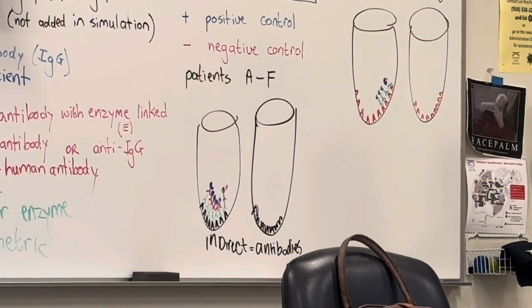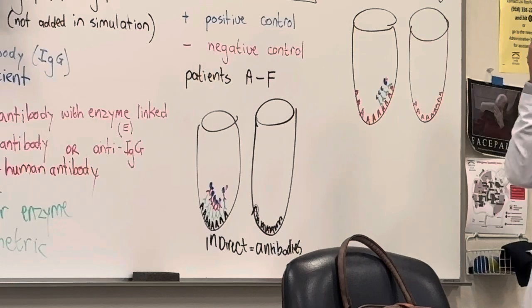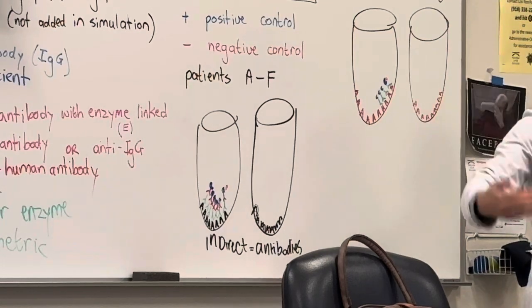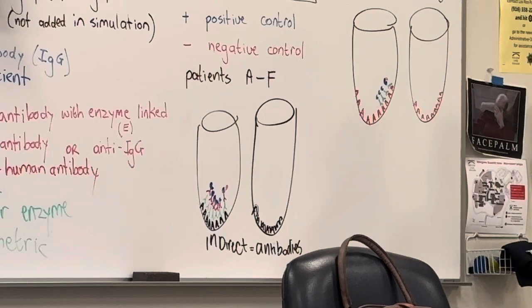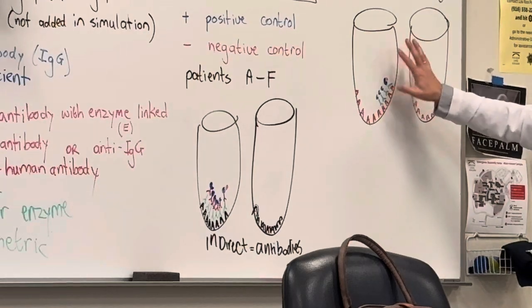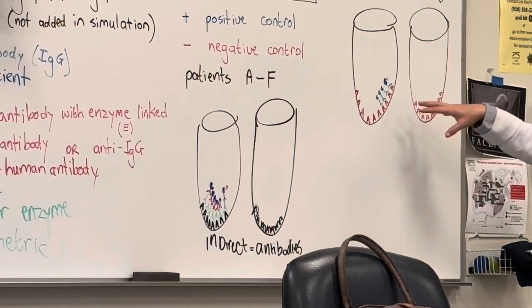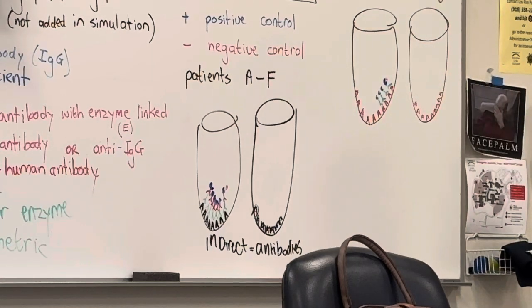You look for HIV. All the patient samples are going to come through, and you have thousands and thousands of wells that are directed toward HIV. You take 15 patients at a time, and you can test all 15 at once. If one of them comes up, you're like, that one's HIV positive. So you can look at a bunch of patients at once. If you're not 100% sure what your patient has, you can put the antigens in there and test for all things simultaneously. You can test for 5, 7, 12, hypothetically hundreds of different viruses at the same time.